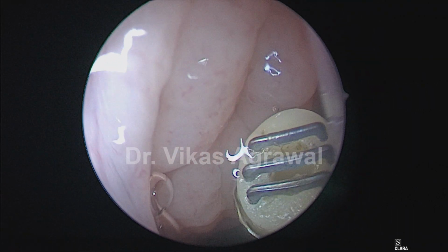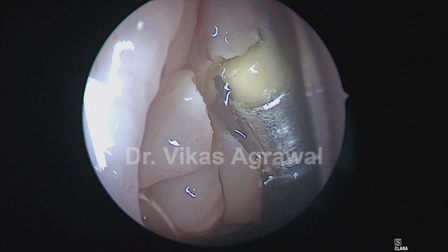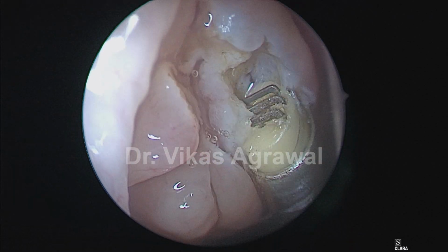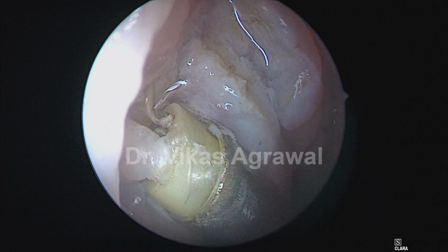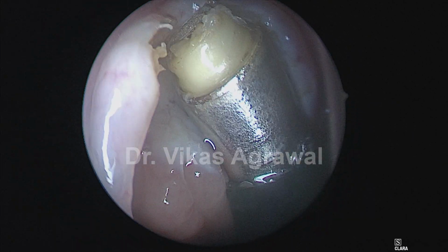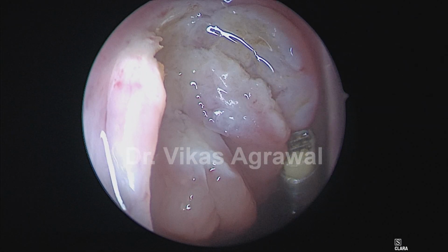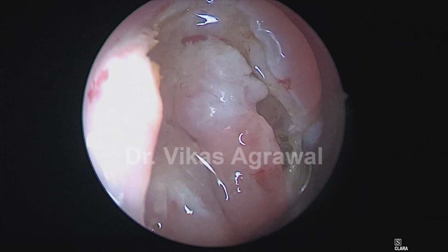So here you are watching coblation adenoidectomy in a 13-year-old female. Huge tonsils, we have already operated, and now we are going for the adenoidectomy, starting at a setting of 9 and 4. Okay, so we are starting at a setting of 9 and 4, 9 for ablation and 4 for coagulation.